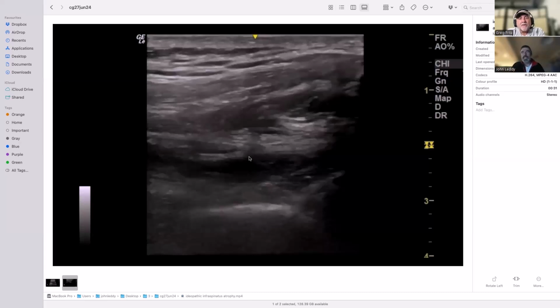But it's not really part of the rotator cuff. It doesn't really attach. When you look closely at where the fibers go, they're quite a long way down on the back of that greater tuberosity. They're not really covering the humeral head at all. They're whisking down below. They probably do brush over the inferior part of the capsule, but they're not really inserting round onto the posterior facet.